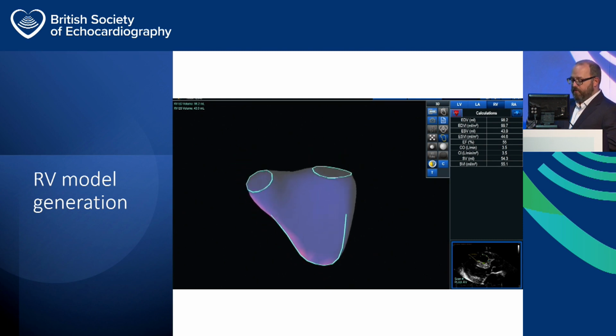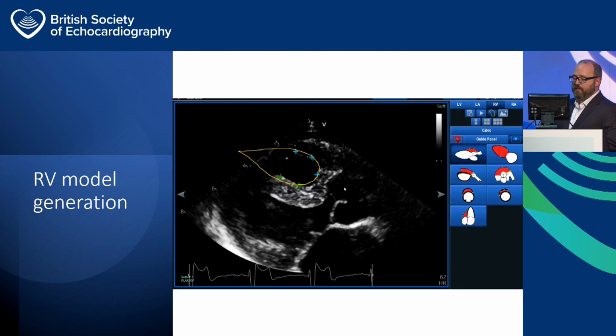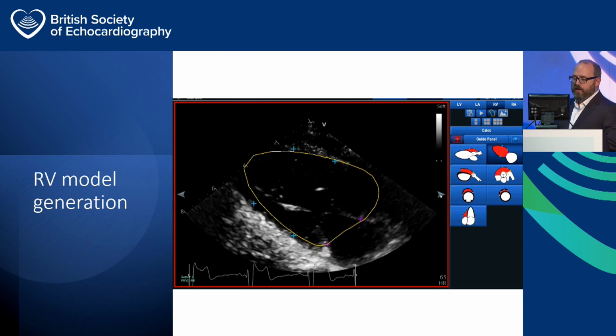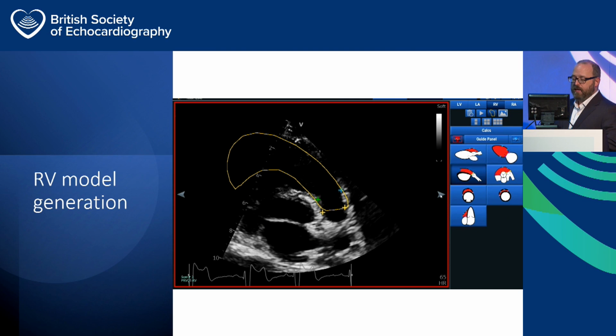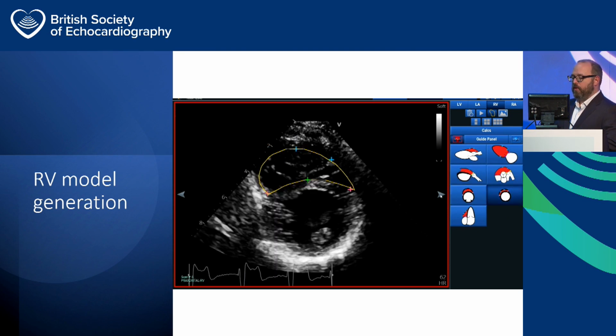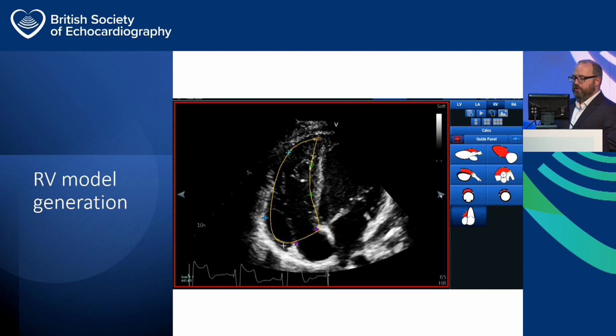This isn't tracking, this is using the heart rate to just animate that, but it gives you a good idea about which area of the heart is moving between systole and diastole. And then this is an overlay of that 3D model on the 2D images to demonstrate how they intersect and run through that, which you use as a way of reverse validating the results. So here you can see in relatively few stages that you can get these accurate RV volumes.